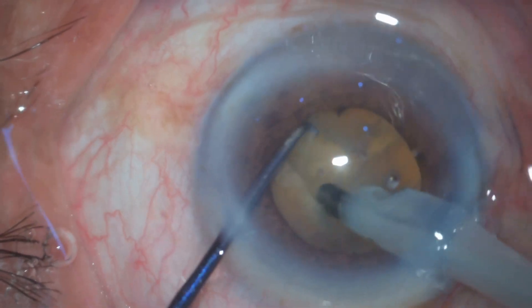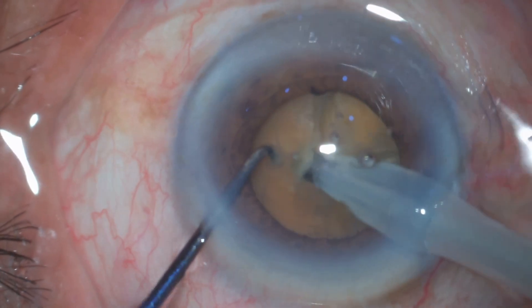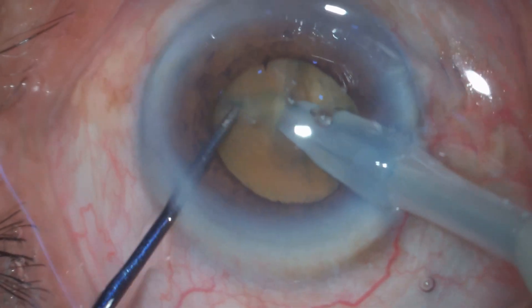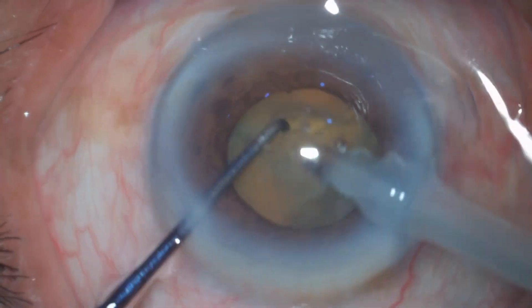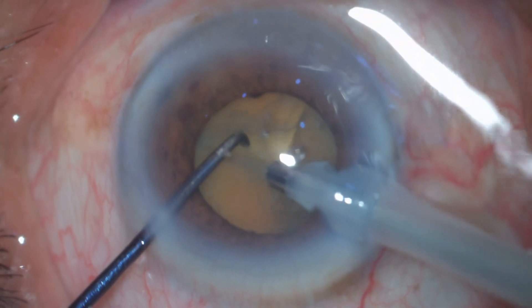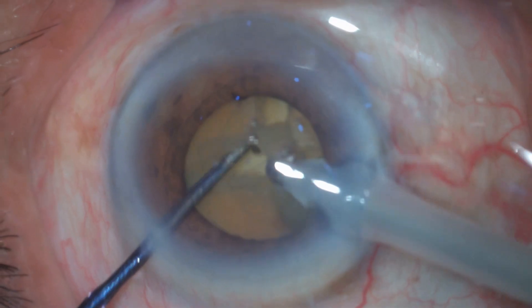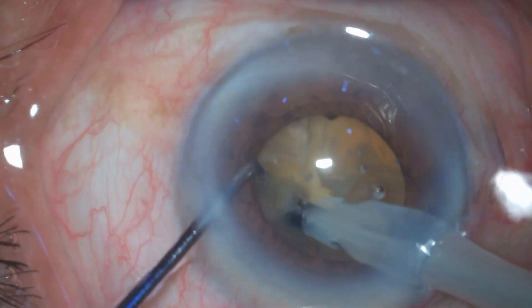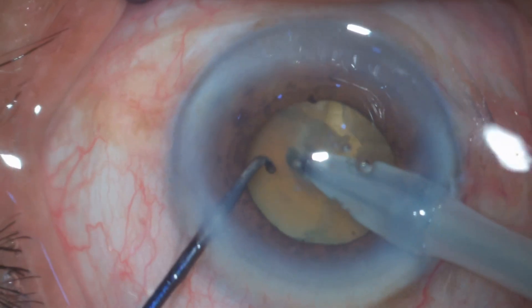At the same time I go to the periphery, cracking the nucleus, and after getting a partial crack I'm separating the endo nucleus from the epi nucleus. This is my technique of debulking the nucleus and creating a bowl or cavity into the center of the nucleus. After removing all of the endo nucleus, I go to the periphery.